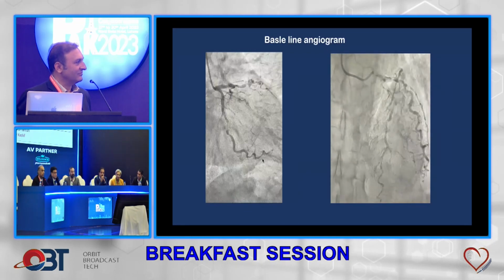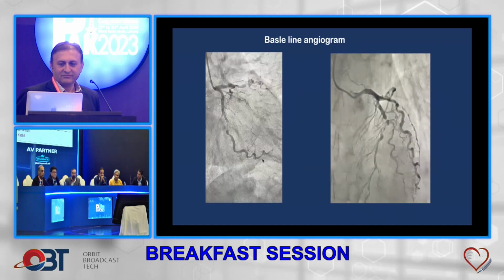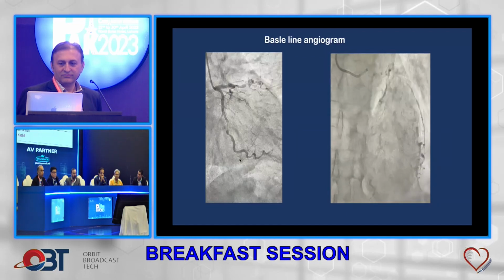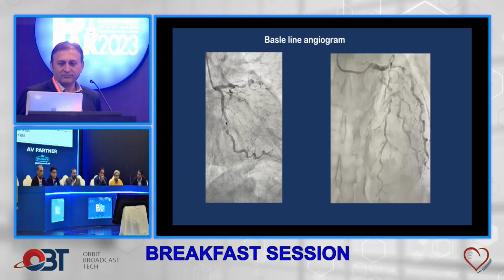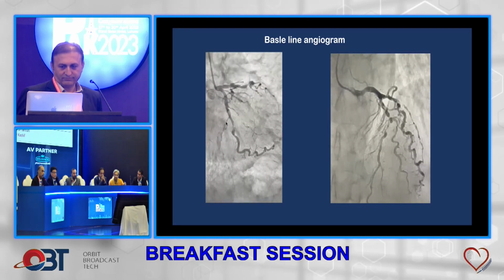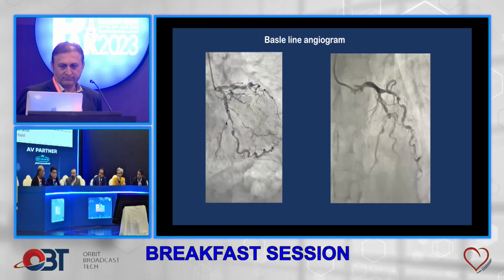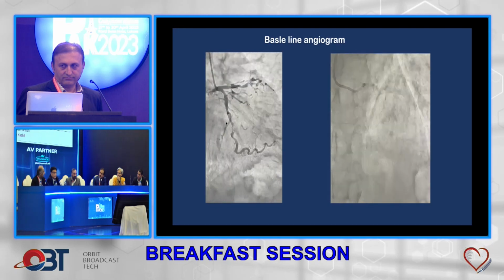So you see, when you have this kind of an LAD, you already know, if you look carefully, that the distal LAD fills from a very small collateral which is over there. So your desire is to get into that very point. The most tricky part is to place your wire at the right place over there. Does anyone have the concept of bringing a balloon in over a wire, inflating the balloon so that the wire stays central?